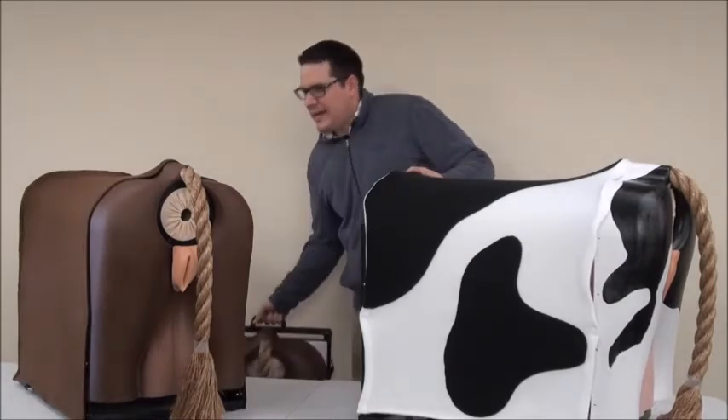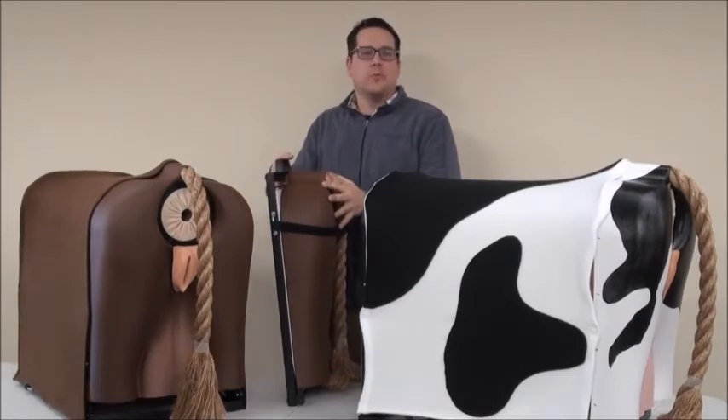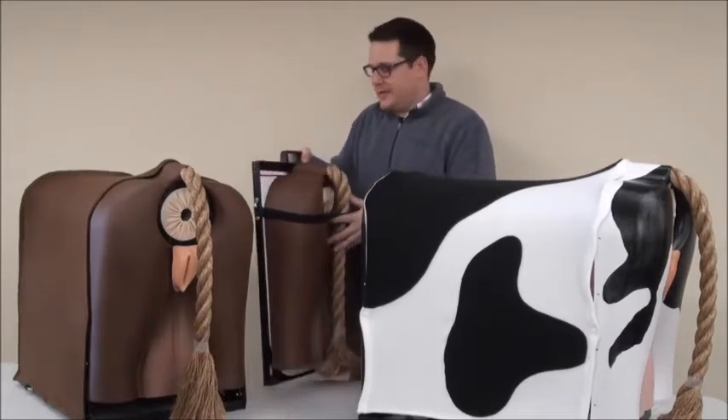With the Bovine Breeder, it actually collapses down into a compact form for portability and easy storage, allowing it to move from classroom to classroom or from place to place as needed.